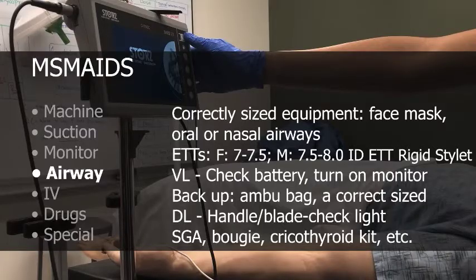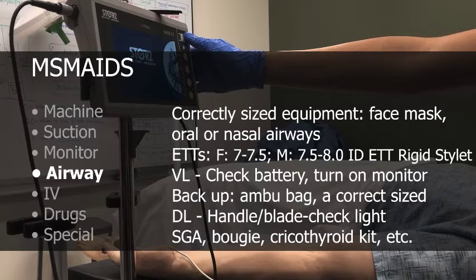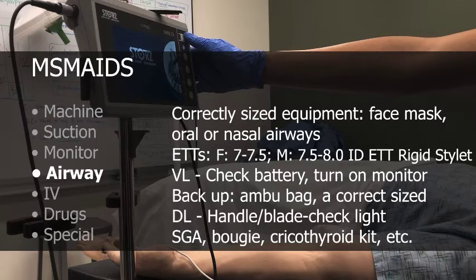While most of this airway section correlates with direct laryngoscopy, what is unique to video laryngoscopy, or VL, is the use of a monitor for indirect visualization of the airway and the therefore necessity to turn it on prior to use. This is to ensure the screen and camera are fully functional and have sufficient battery life. A specialized rigid stylet is also used for intubation via VL and should be inserted into the ETT. Like intubation via direct laryngoscopy, a 10 ml syringe should also be attached to the pilot balloon.